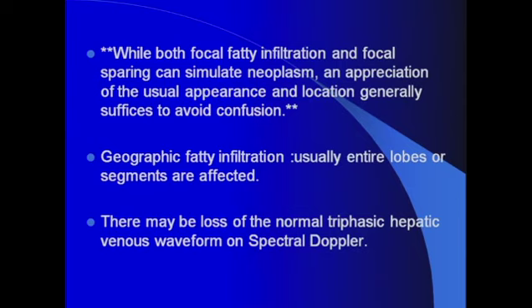Look at the vascular structures coursing through that area of increased or decreased echogenicity, in other words, fatty sparing or fatty infiltration. If you don't see any splaying or distortion of the course of these vessels, this is most likely focal fatty sparing or focal fatty infiltration, depending on the echogenicity.